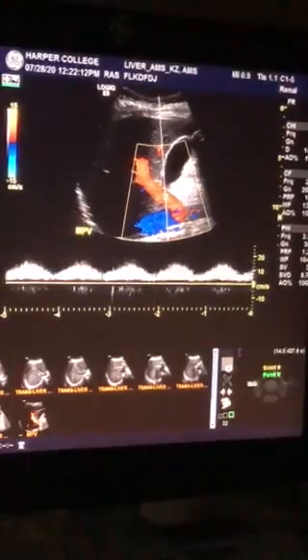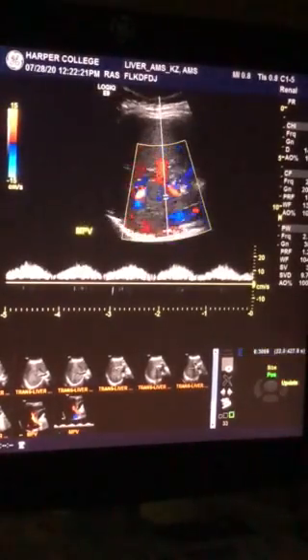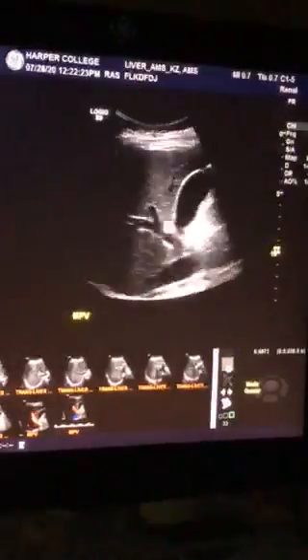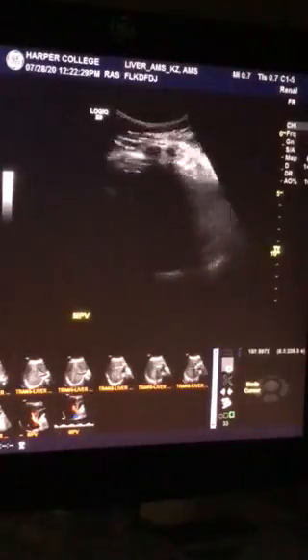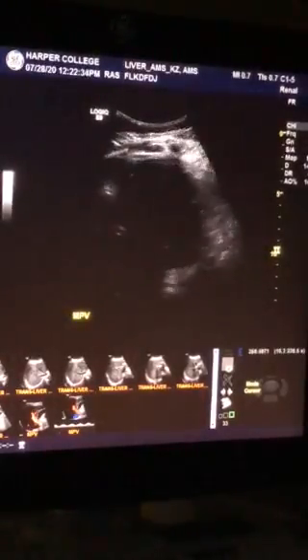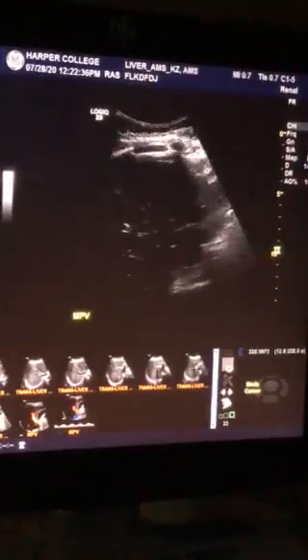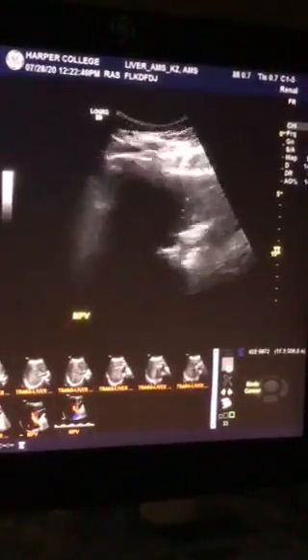And breathe. Like I said, we just want to make sure it's continuous. And then the last thing I'm going to image is the common bile duct. You can see that running with the portal system and the hepatic artery. And we want to try finding it dumping in, as close to dumping into the pancreatic head as possible. All right, when you're ready, deep breath in.